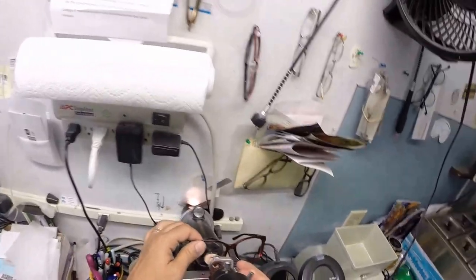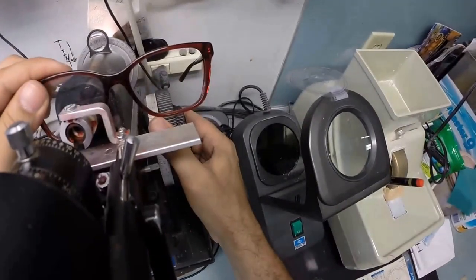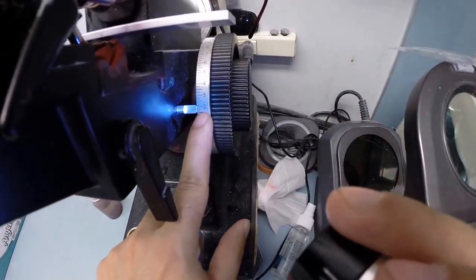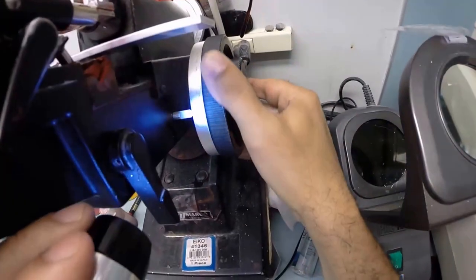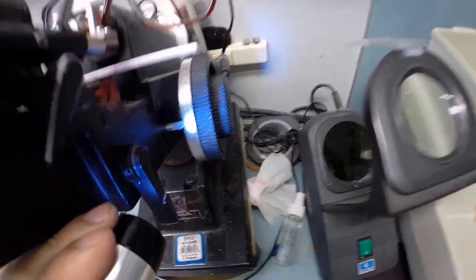I'm going to raise it up and read the bifocal power, and I'm getting, what am I getting? I am getting plus 1.75: one, one and a quarter, 1.50, 1.75, two. In the black. Minus is in the red below the zero on the number scale. We're at plus 1.75.